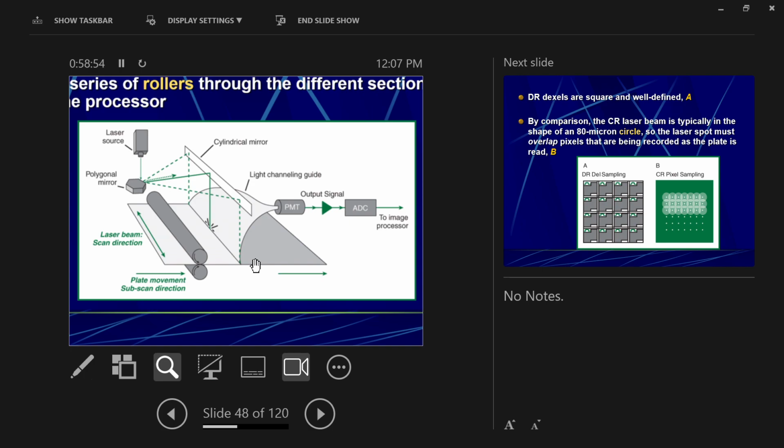Okay? So we go laser beam to mirror. This mirror can move, directing the laser beam at a cylinder shape. I know it's not a cylinder in this picture, but at a cylinder shaped mirror that directs the laser light downward towards the plate. Okay? So what's important is that the green lines make their way down to the plate. Okay? And it's just reflecting, like literally a mirror.